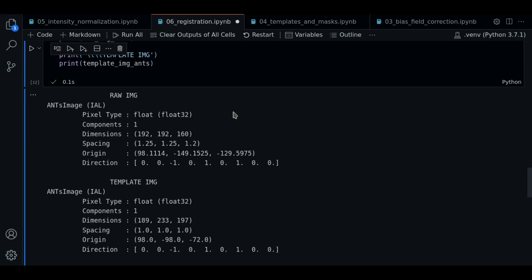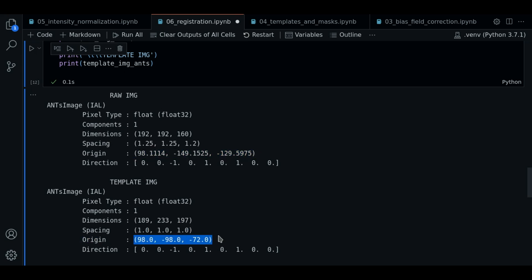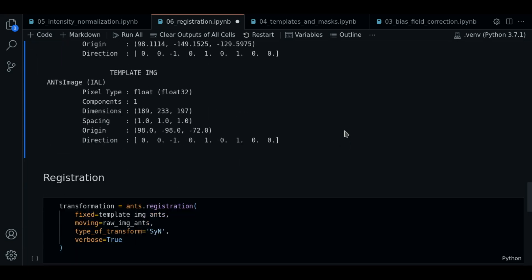So as you can see, some items are different. For example, dimensions are different, the spacing is different, and even the origin vector. It is important to make this analysis because the registered image will have the same information as the target image.